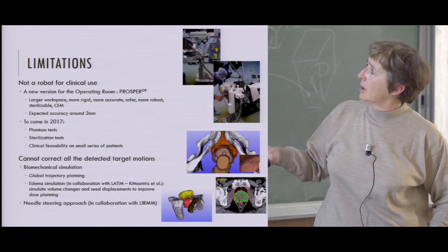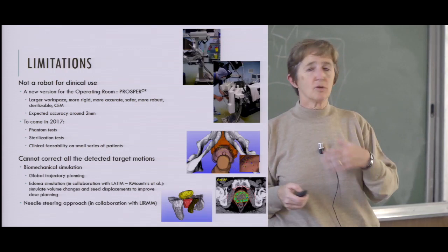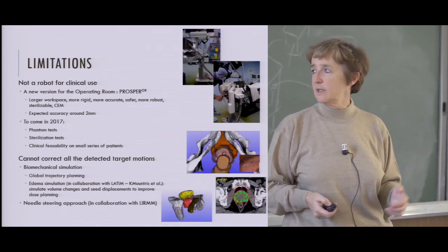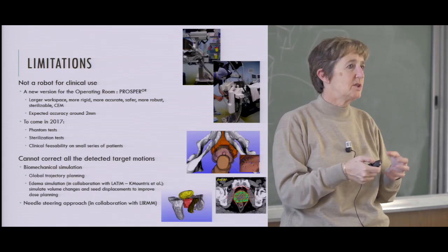Like I said, the edema is the inflation of the prostate due to the inflammatory effect. And so we try to model it using finite element models, poroelastic models, so that we can consider that for dose calculation, because when you put the seeds, they are somewhere with a certain configuration of the prostate, but it moves, and so you have to take this into account.